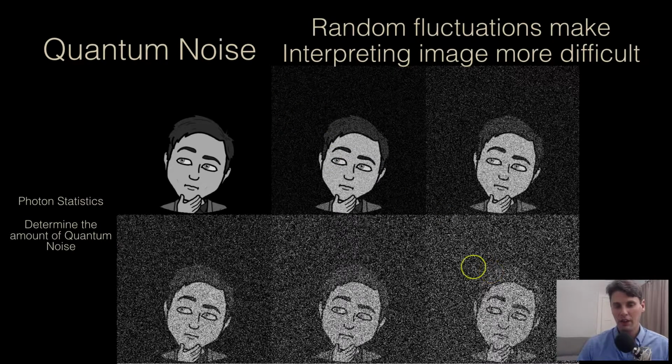We can think of this being lower dose images down here. And now you can't differentiate anything, for instance, inside of my hair. So here you can see these little structures inside my hair. Those are completely gone here when we go to the lower dose image. But you do see that you still can see my eye, you still can see there's a pupil in there, you still can see my hand. So it all depends on what your task is in terms of the appropriate radiation dose.